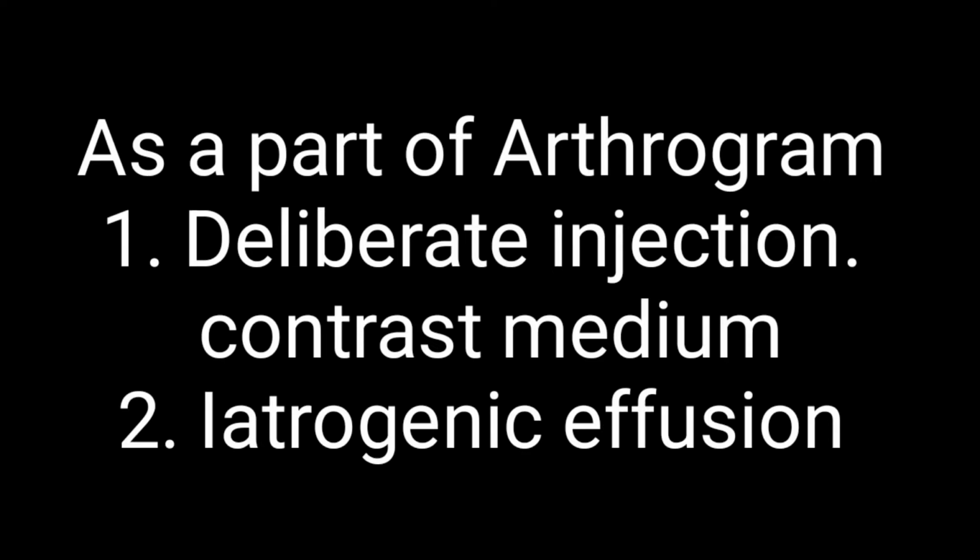Sometimes this joint effusion may be caused by deliberate injection of contrast medium, or sometimes it will also be considered as an iatrogenic effusion when you introduce some medication in it and it results in effusion.